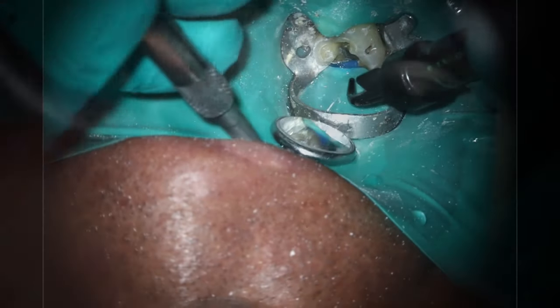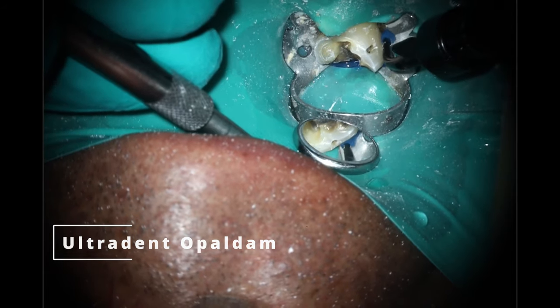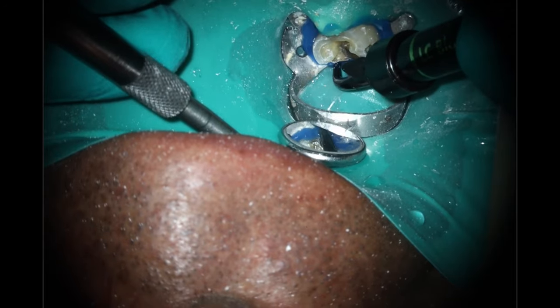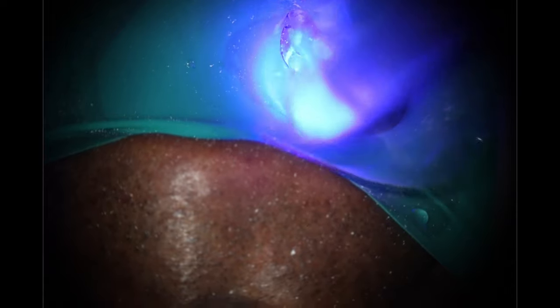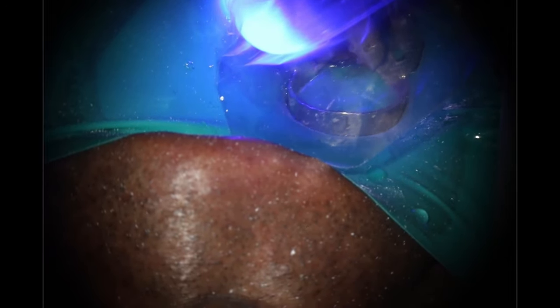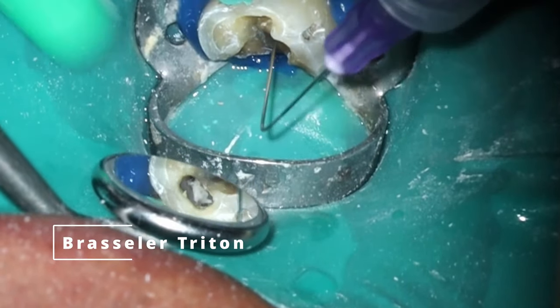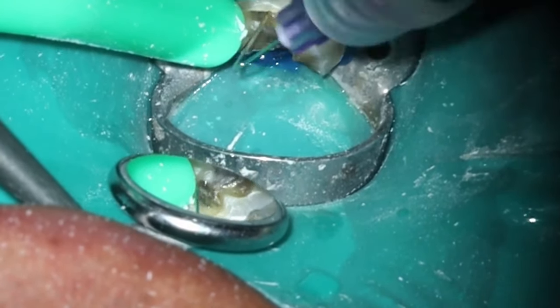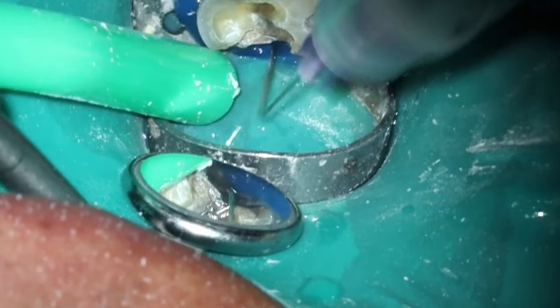Now there are questions going to come up about the area in between. The term — I think Michael Trudeau may have coined it, but it's certainly not mine — is the truss-style access. For an access like this, there is tissue underneath the truss. Think of it like a bridge — there might still be some material in there. I've never seen a case fail because there's a small amount of pulp tissue remaining underneath there. There are some ultrasonics you can use, and we're rinsing with bleach and Triton, trying to get as clean as possible.